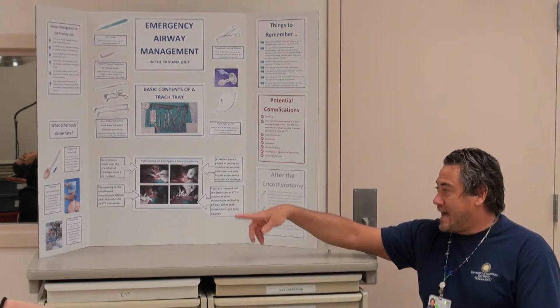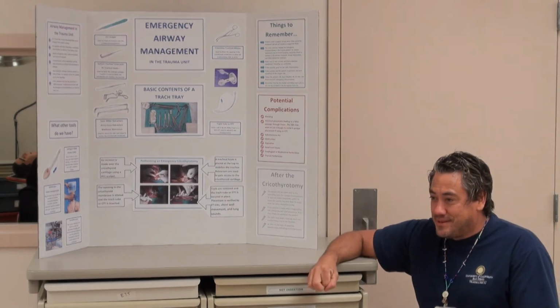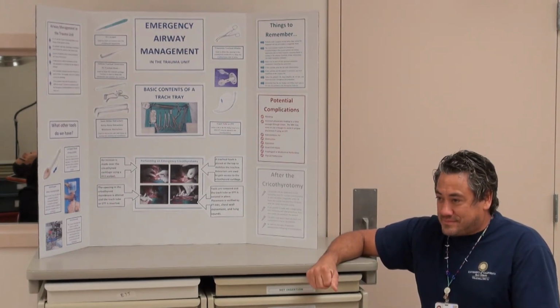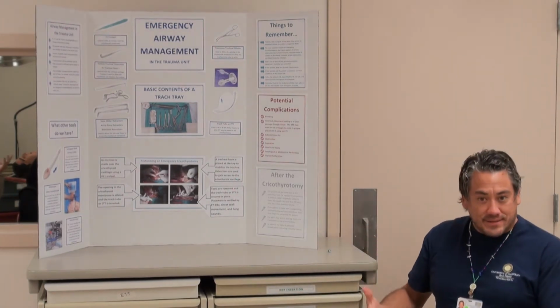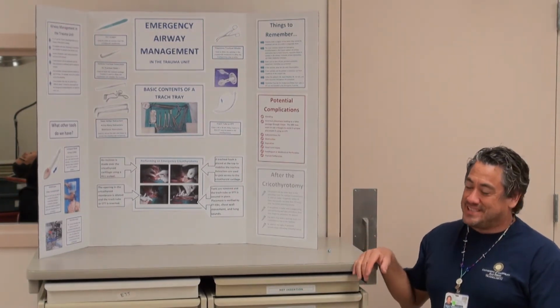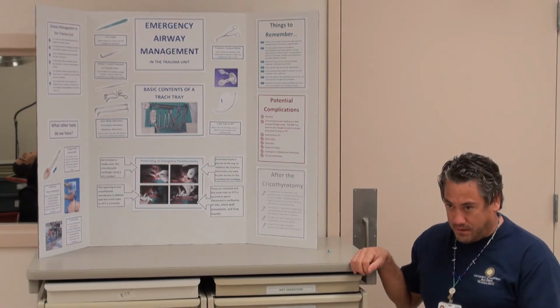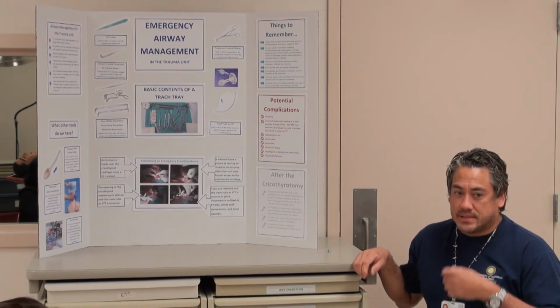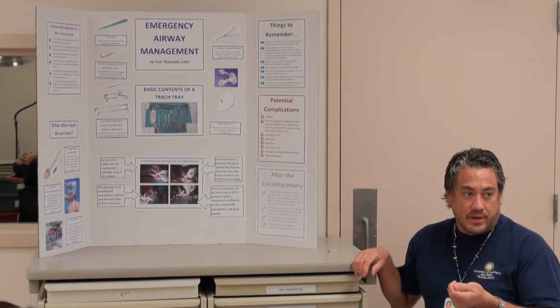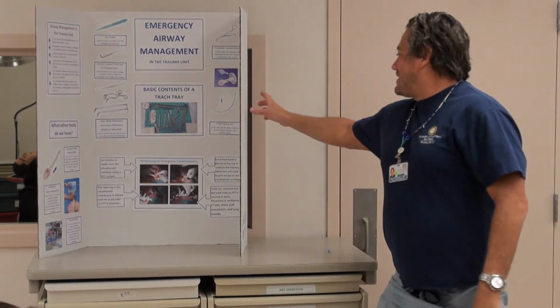So it's nice to have these things, whereas when we first started... The other day one came in with an LMA, and it was great, because they were oxygenating just fine, and nothing's going into the stomach. Because that's the worst when you have the Combitubes, and that's a nightmare, because the second you try to pull that out or do anything with it... So, all right. That was that.